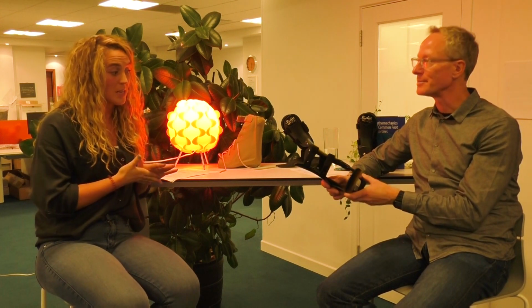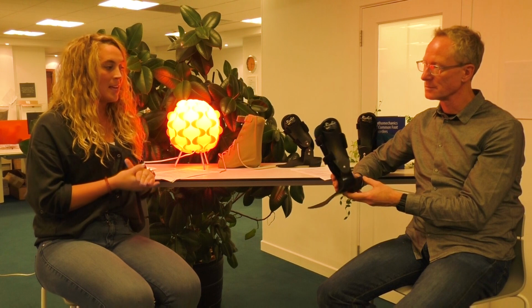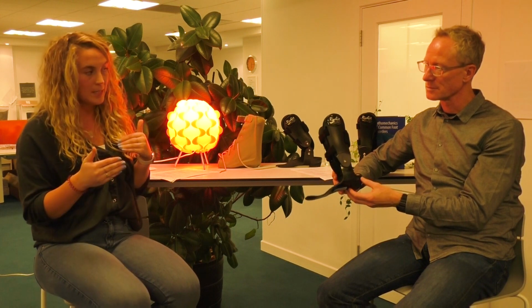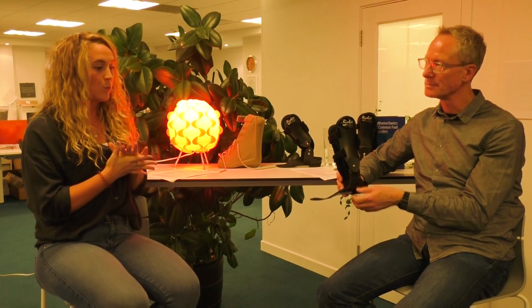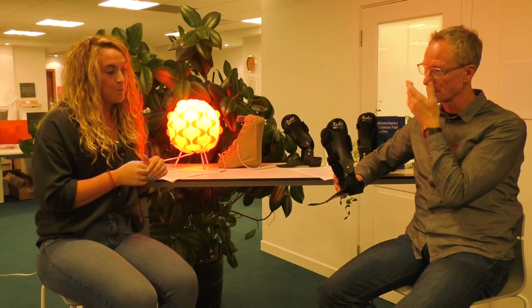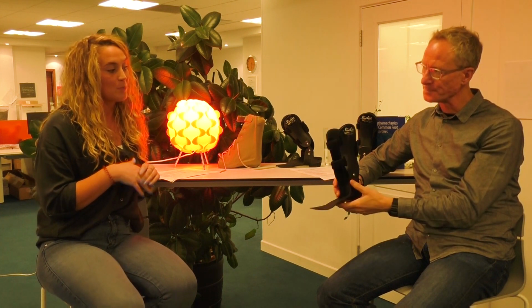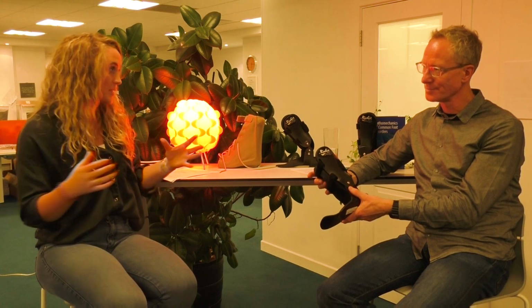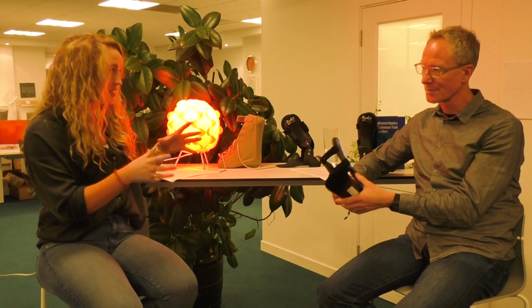It's how to manage the patient expectations, definitely. I suppose the only other part with adult acquired flat foot is that if you do want to rehabilitate it, there has to be a solid rehabilitation program. So we have an example of one that we'll provide for you as well, but Doug also kind of said it is about being strong as well from the top down, so it's a full strength conditioning program. It's not just around the foot.